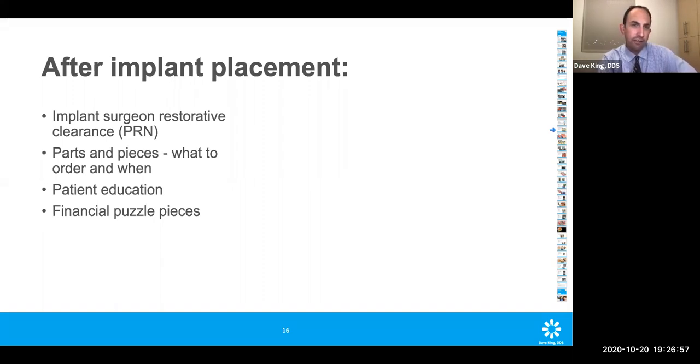There are a couple other presentations that I share, and there's some real specifics in there. A lot of it has to do with the implant size and the restoration height, the implant restoration space, and then also the volume and how much distance you've got on the cantilever.